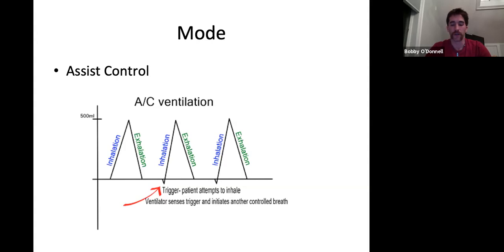So if we have our respiratory rate set to 16, we look at either our monitor, on a respiratory lead or end tidal, or on the vent itself, it will have the letter F, which stands for frequency. That's how many times the patient's actually breathing. If you see that they're over-breathing the set rate, they need more sedation or they need pain control. That's really important to recognize. Otherwise, they're going to get an egregious amount of tidal volume.